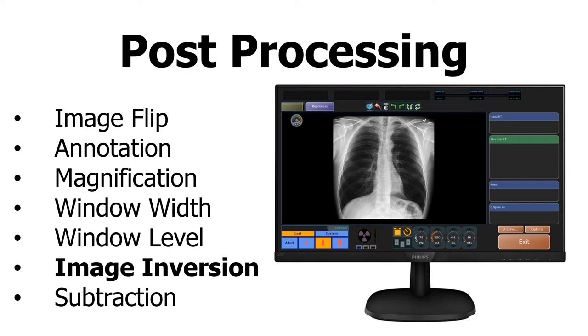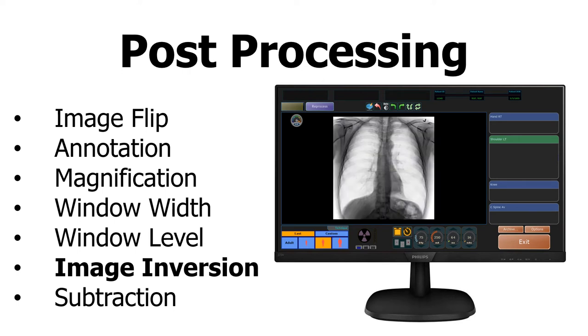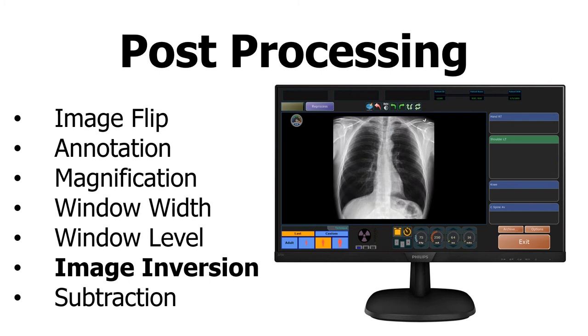Image inversion allows you to change all of the blacks into whites and all of the whites into blacks. This is a useful tool when looking for rib fractures or other very small fractures.